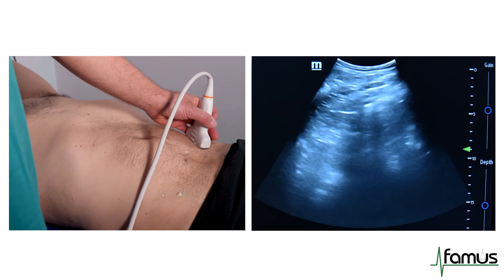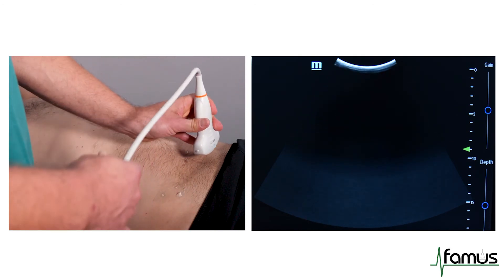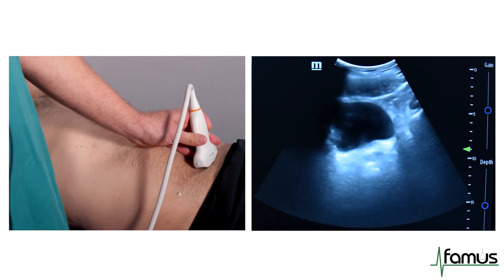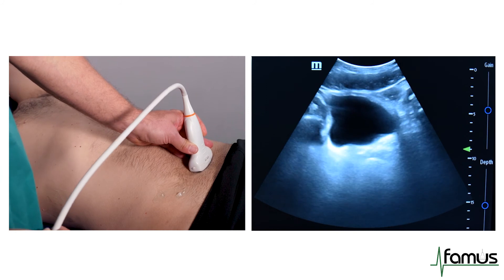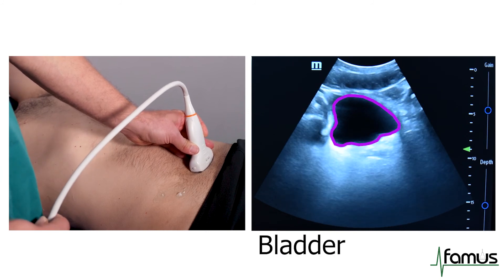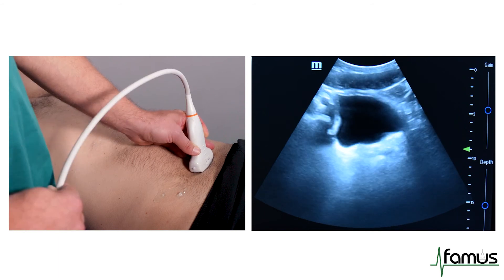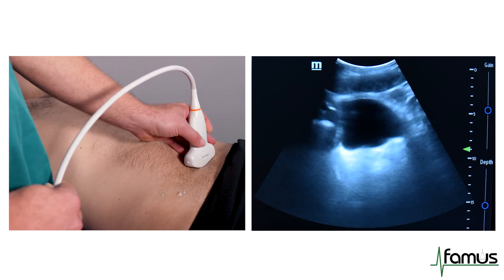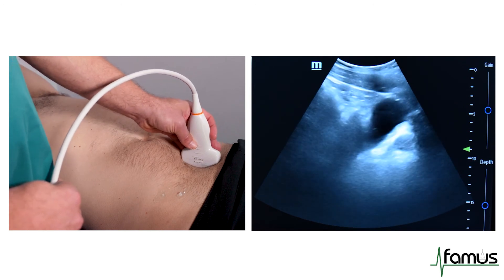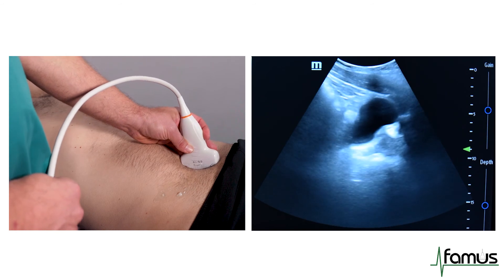Finally, we will scan the pelvis with the marker dot towards the right hand side in a transverse view. We are then rotating our probe into a longitudinal view, and may have to rock our probe a little bit more intra-pelvically.